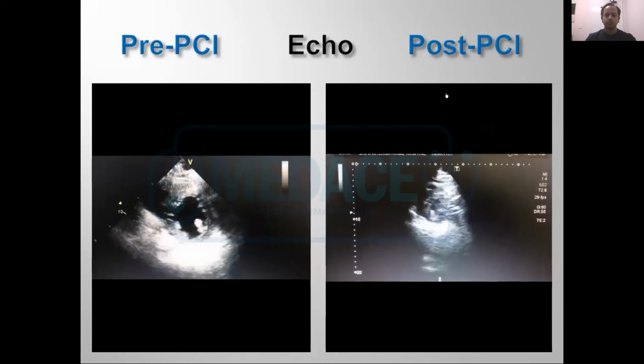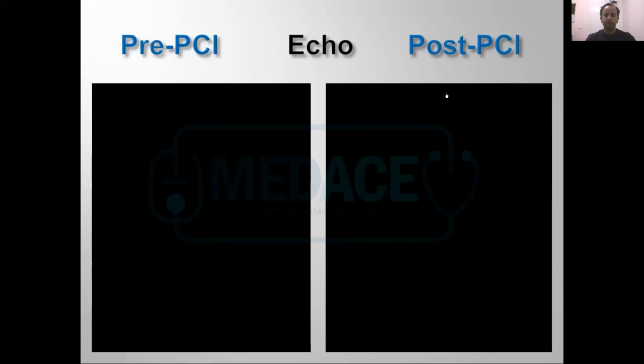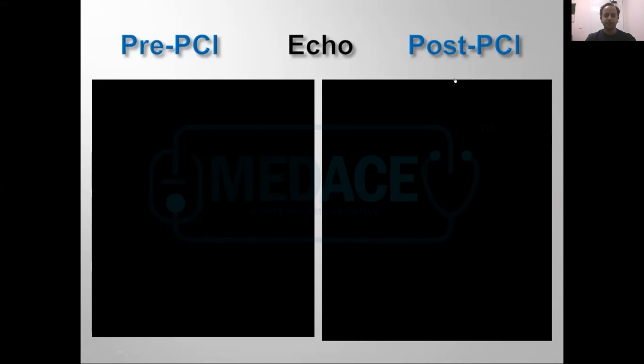So this is the post-procedure echo, which shows significant improvement in the LV contractility. And this is the post-PCI view, which shows the LV has improved significantly.